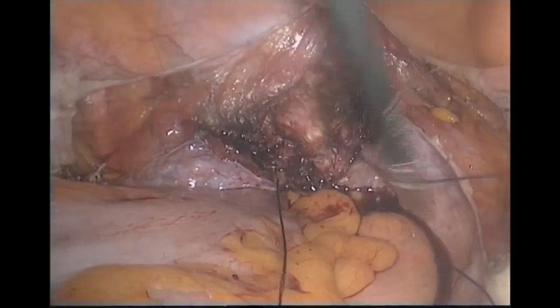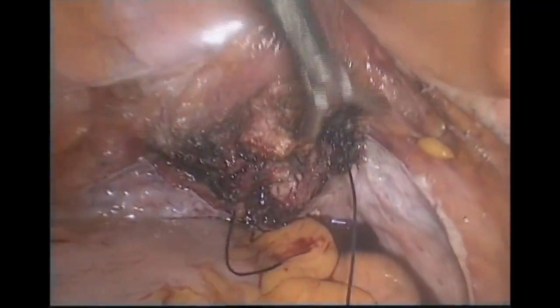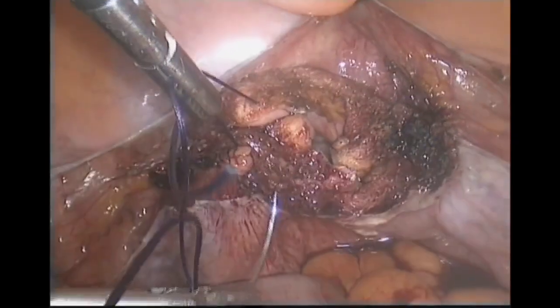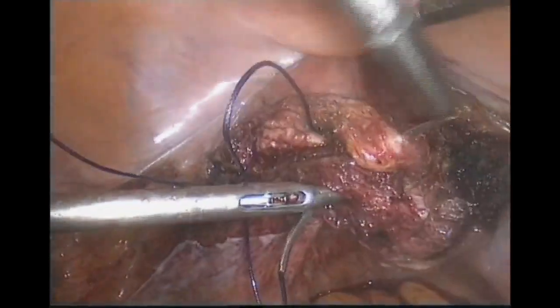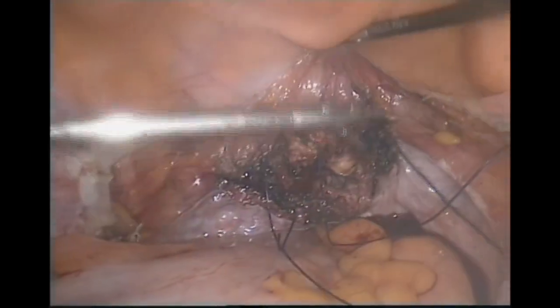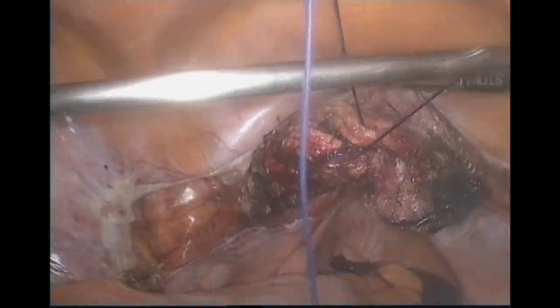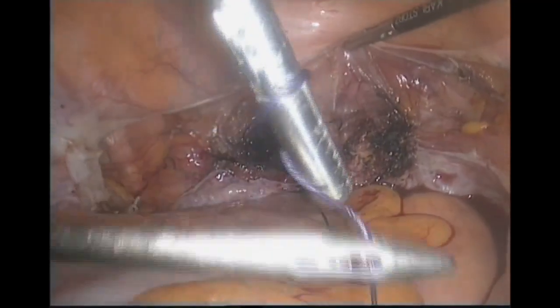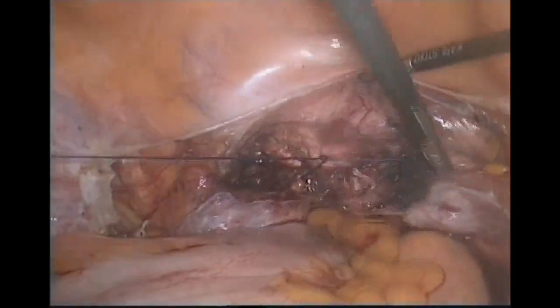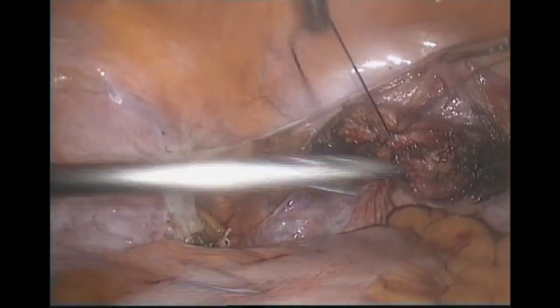So we go to the vaginal vault closure and hemostasis. Laparoscopic suturing is preferred over vaginal, with delayed absorbable Vicryl intracorporeally, including the uterosacral ligament for apical support, McCall-type culdoplasty, to reduce the vault prolapse. Ensure full thickness bites, and include the vaginal epithelium.